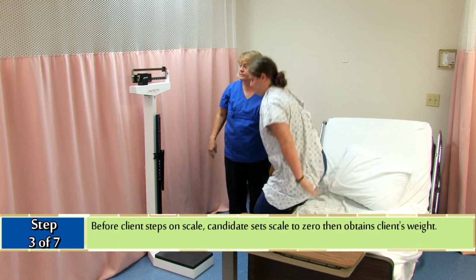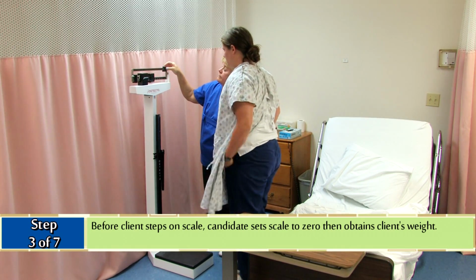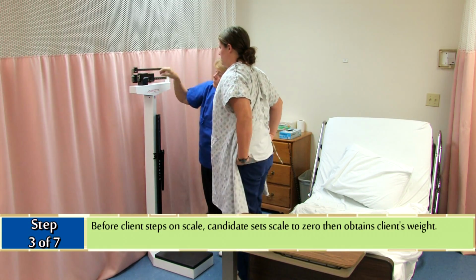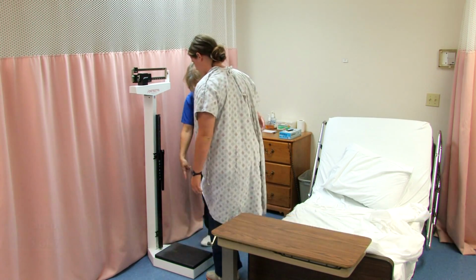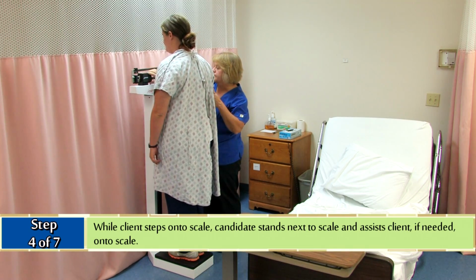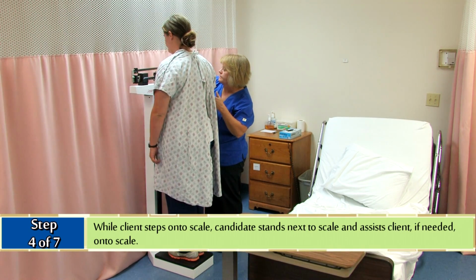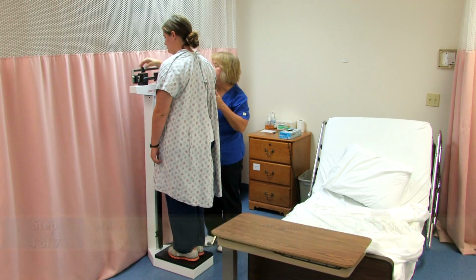Step 3. Before client steps on scale, candidate sets the scale to 0, then obtains the client's weight. Step 4. While client steps onto scale, candidate stands beside her next to the scale to assist the client, if needed, to the center of the scale.